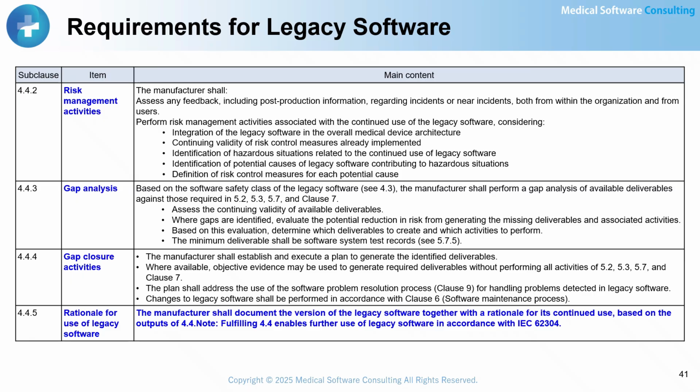Clause 4.4.3, Gap Analysis. Based on the software safety class of the legacy software, manufacturers shall perform a gap analysis comparing available deliverables, such as those created before IEC 62304 was applied, against the requirements of the standard. In the gap analysis, assess the continuing validity of existing deliverables.